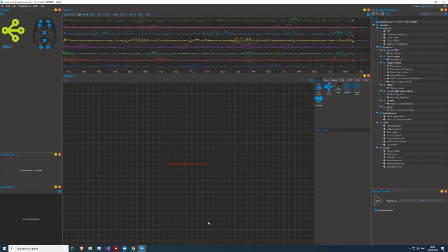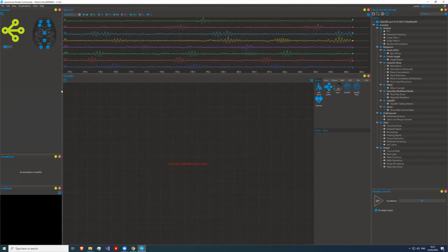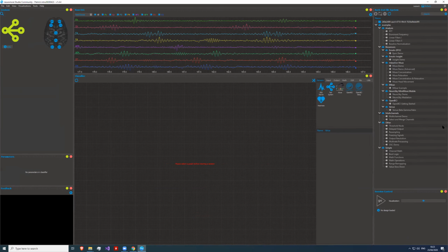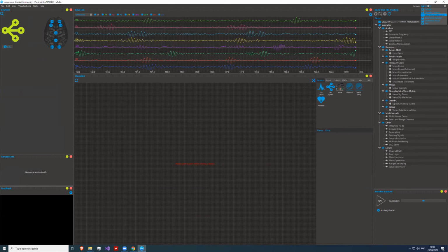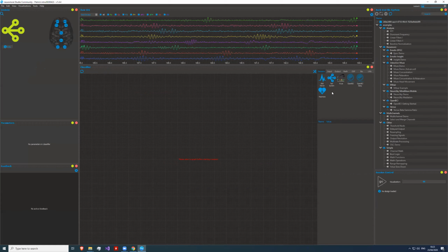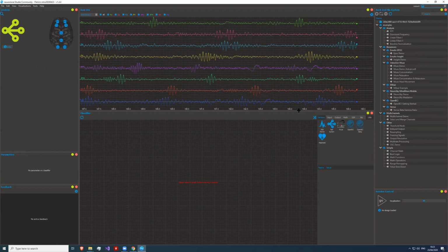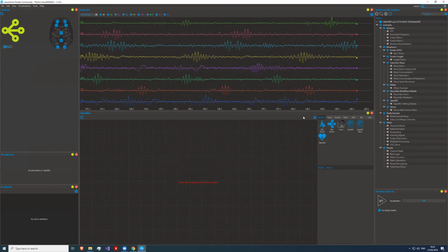Good point. So the neuromore Studio itself consists of different windows, so you can move them around. You're pretty flexible with what you do. What we see here is just the default layout. There are different layouts that we pre-built, but feel totally free to create your own layout. You can close windows, move them around, move them to another screen, and have multiple screens.